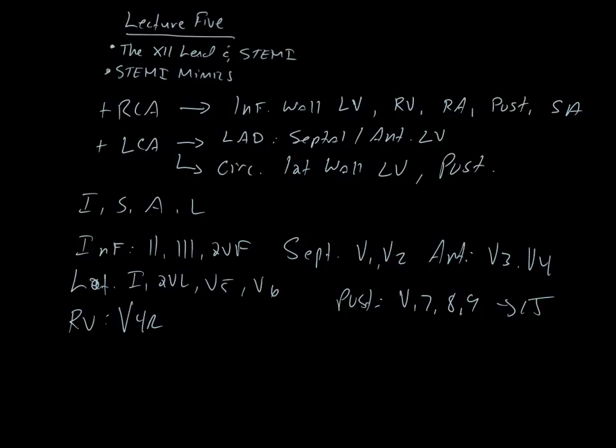All right. You're good with what the implications of hyperacute T wave changes are? You get the tall peaked T waves in the first few minutes of the onset of a STEMI. Do we see that often? No. And then we get ST elevation, right? We can get ST depression. Depression indicates ischemia, elevation is injury. And then what's the other thing that can develop after hours? The pathological Q wave. Right, the pathological Q waves.